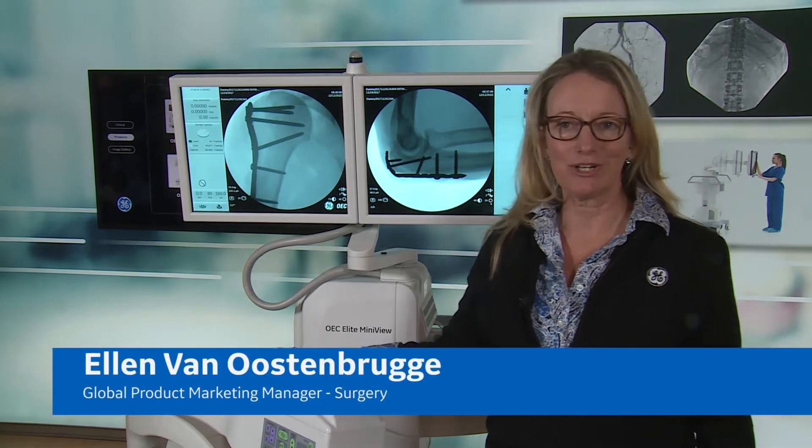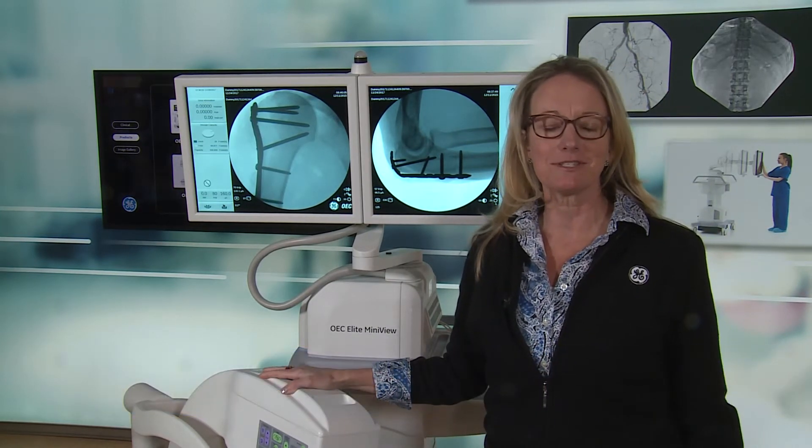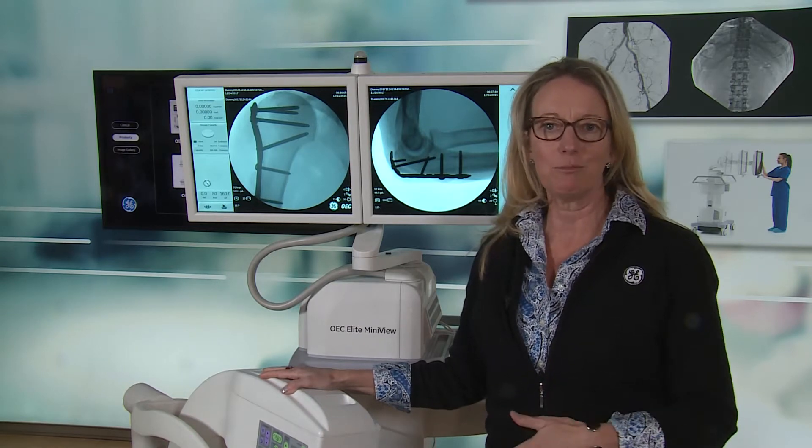Hi, I'm Ellen VanIstenberg, the global manager for surgery. Today we're looking at the OEC Elite Mini-View, which is designed for extremity surgeries — hand, foot, and elbow surgeries.